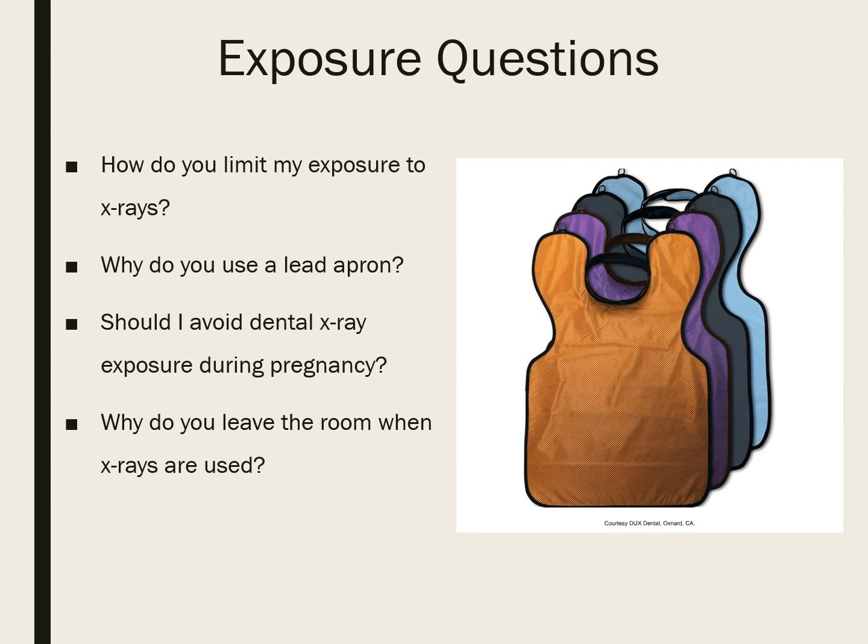And then the last way is that we are using a film holder or a beam alignment device of some kind, which we talked about in chapter 6. And that is how we make sure we get a good diagnostic radiograph the first time.